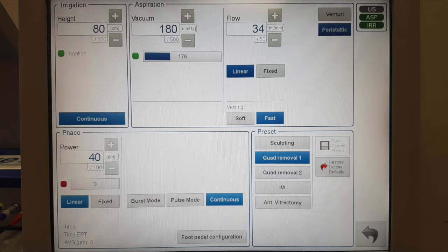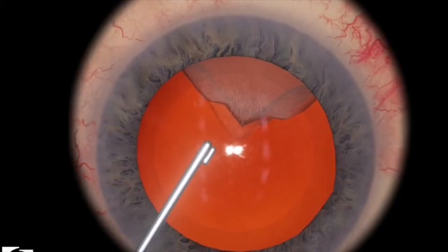Here are the OR settings that I use. I simply leave it in quadrant removal 1 — that's what the machine defaults it to. The only change that I make is that I set irrigation to continuous, that way I don't have to be in foot position 1 when I enter the eye.